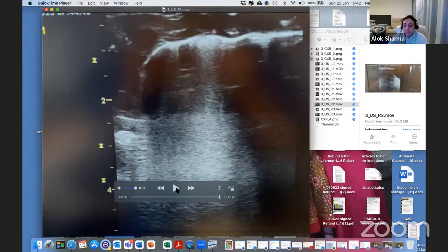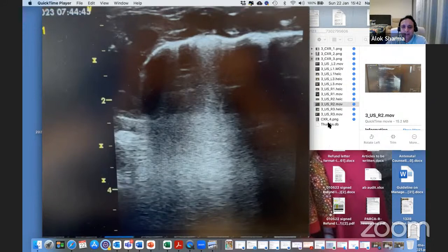And the reason you get an A profile is because you get air trapped in areas beyond the areas of chemical pneumonitis to start off with. I mean, an expectation from my perspective, when I had a look at that first chest X-ray, was to find a complete B whiteout kind of appearance. But what you're giving me here is basically a very patchy appearance with an upper zone of the lung which has A lines and consolidation. And if it has this kind of a distribution, which is very mixed, this is very classical for meconium aspiration. No shred sign, no irregularities of the pleura, goes against a lobar kind of presentation.